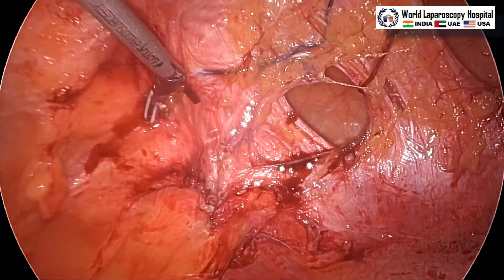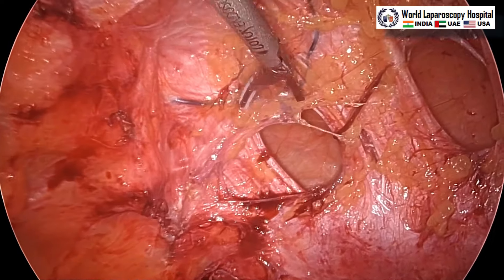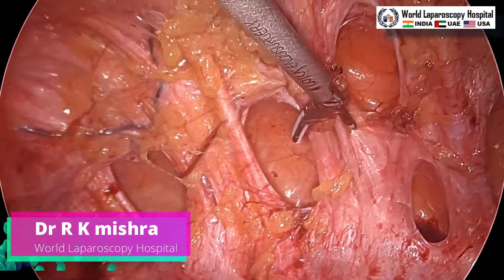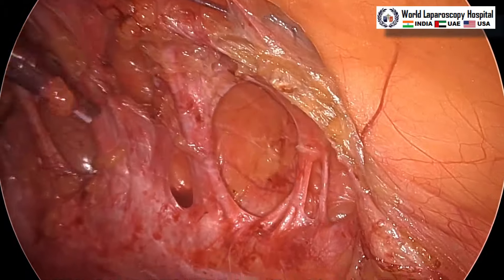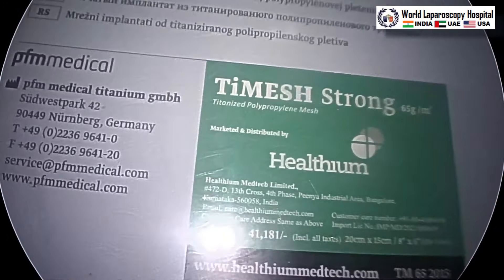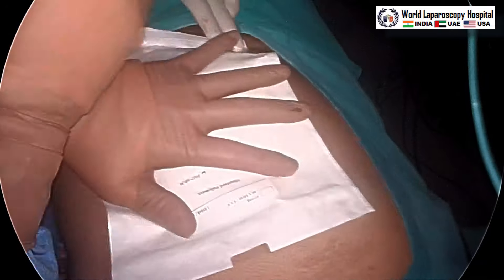Now we can measure: the open jaw of the harmonic is approximately 2 centimeters, so measuring gives 2, 4, 6, 8, 10, 12, 14, 16, 17 centimeters. We will use a 25 by 15 size mesh here. This is the titanium mesh made in Germany — the Thai mesh. This is a reinforced titanium mesh which is very good and very strong, made for intraperitoneal application.